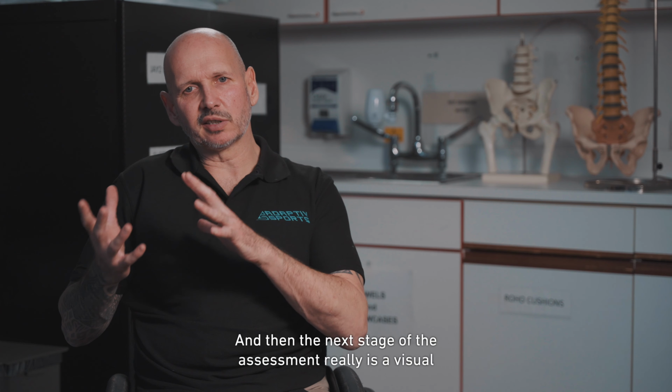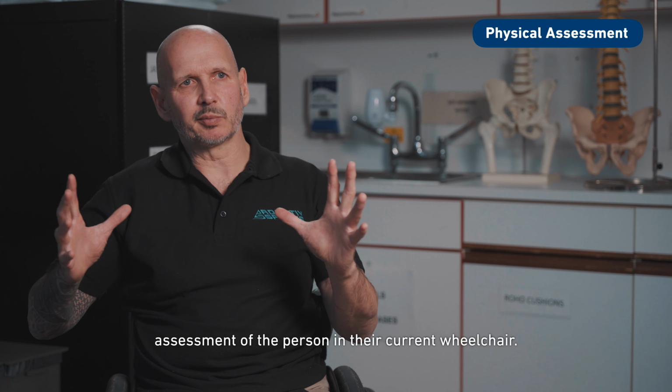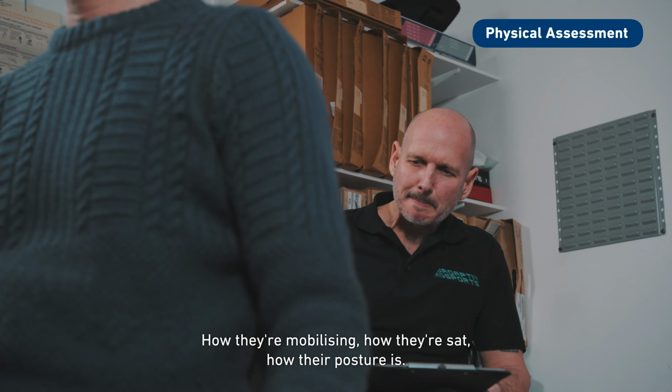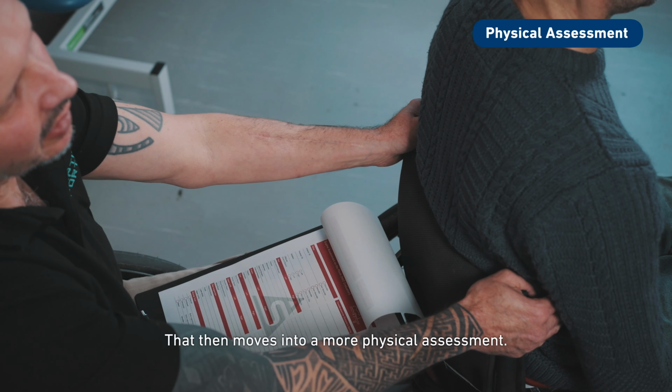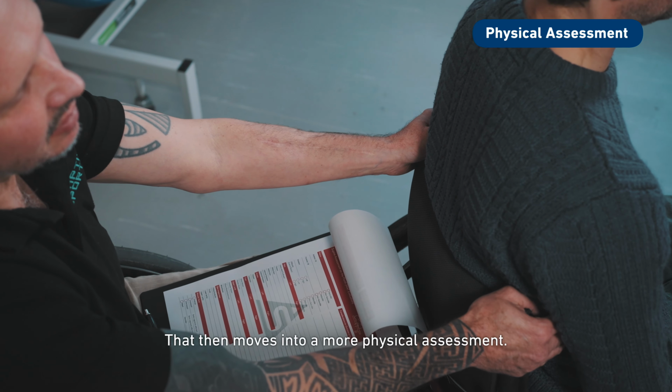And then the next stage of the assessment really is a visual assessment of the person in their current wheelchair, how they're mobilising, how they're sat, how their posture is. That then moves into a more physical assessment.